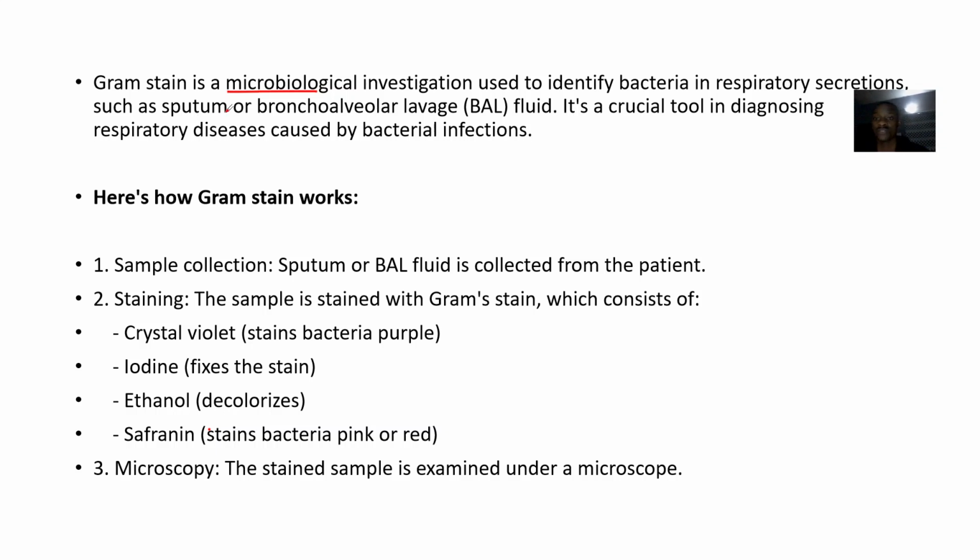Okay, so it is a crucial tool in diagnosing respiratory diseases which could be caused by what? Various bacterial infections. Okay, so for this, how does it work? First of all, you have to collect a sample. So the sample could be sputum or it could be what? Bronchoalveolar lavage. Okay, so it could be collected from the patient.